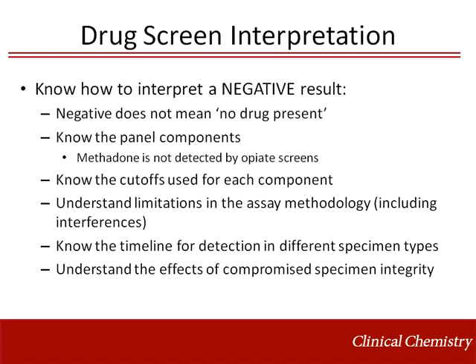A negative result does not mean no drug is present. A common mistake in interpreting negative drug screens is to be unaware of the panel components or cutoffs of the assay used. For example, it is often assumed that methadone, an opioid, is detected by opiate screens. In reality, methadone has no cross-reactivity and will not be detected by a drug screen for opiates. It is important to understand the limitations and interferences associated with the assay and methodology. Information about detection window or effects of specimen integrity on results will help aid in interpretation.